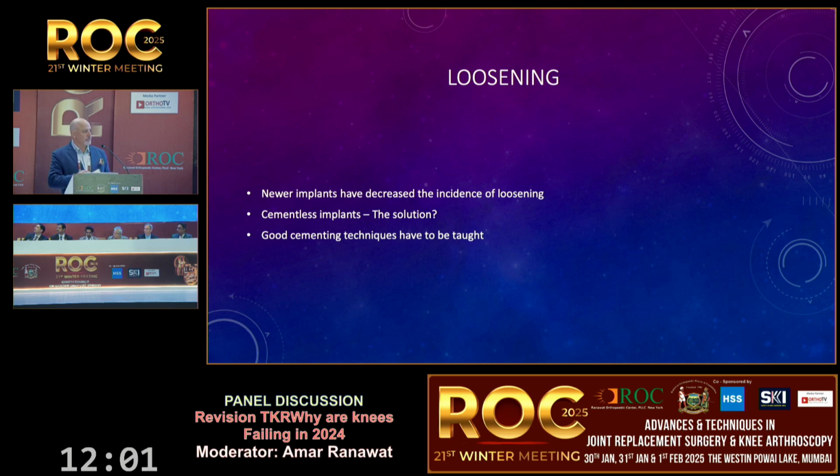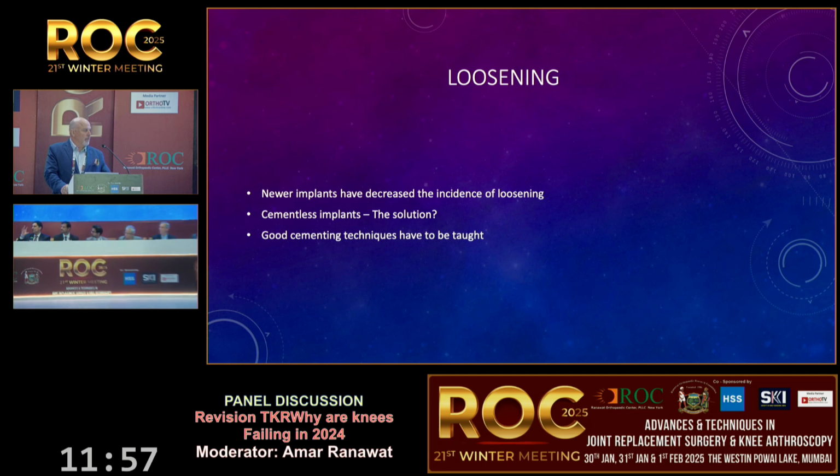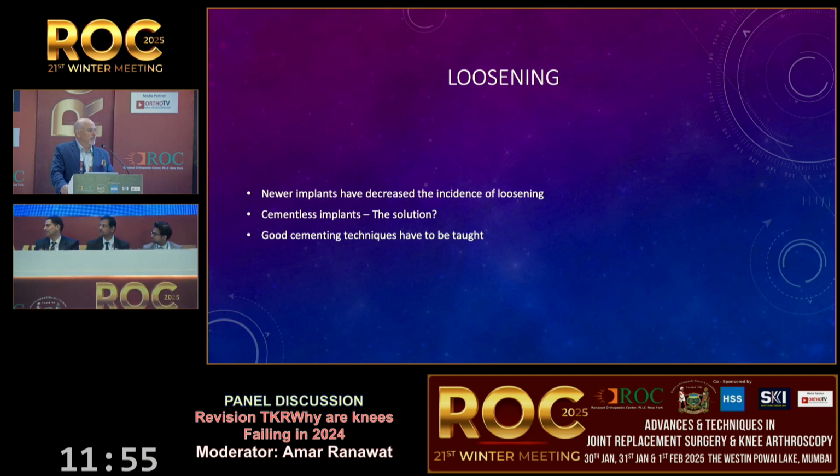But in the hip, we have screws for the acetabulum, just to bank upon if you think that it's not fitting snugly. Yeah, that remains a challenge with this, especially with the tibia. And I've been in cases where we've cemented hips in if we didn't like how things were coming out, right? But as you get better at it and more experienced at it, you get to a place where you gain the confidence.